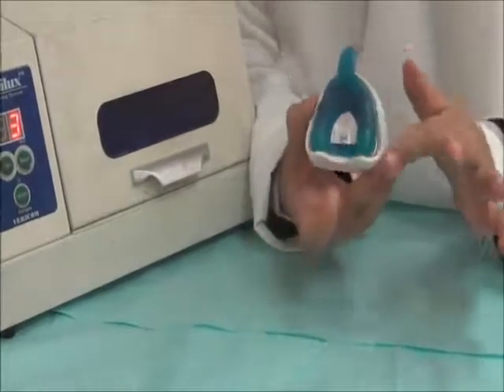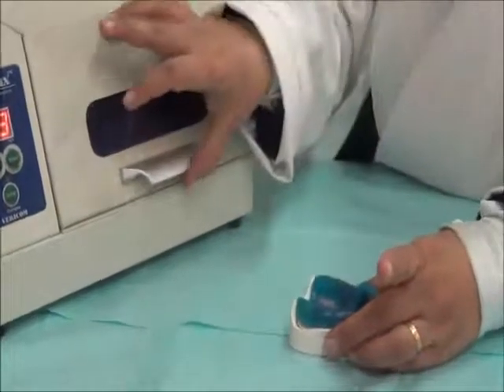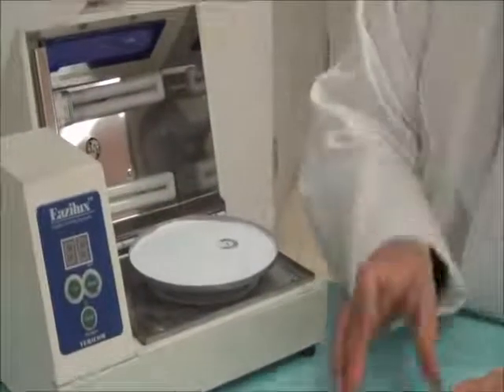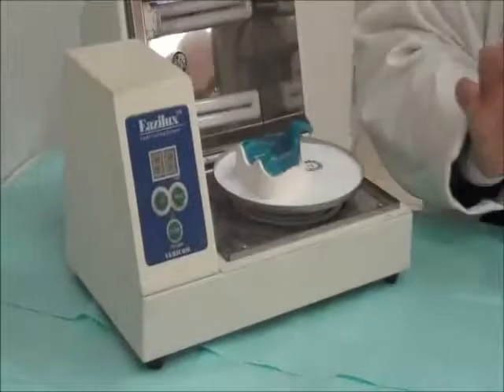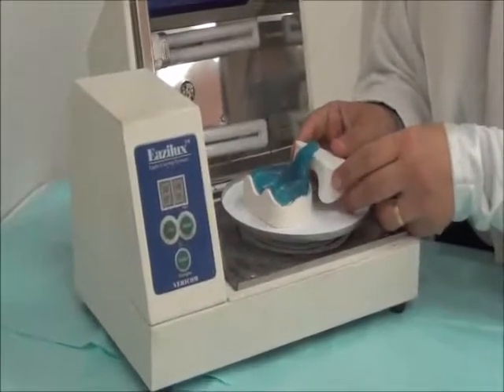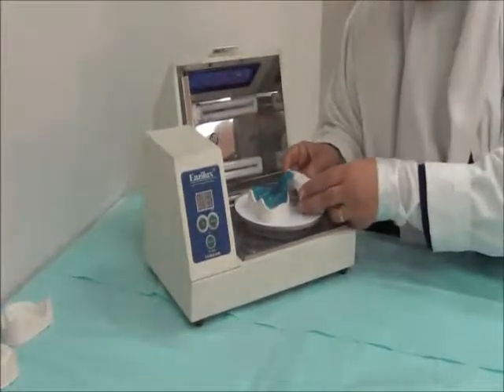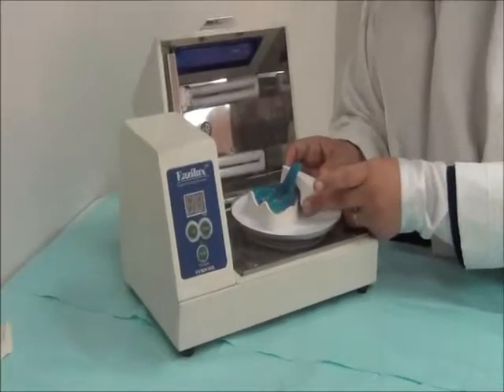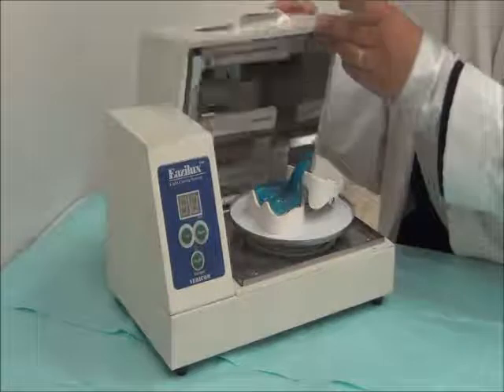We also make sure that there are no projections inside the sulcus outline, because it's easier to remove them when it's soft acrylic than in the final material. We place it inside the light cure. We might get another cast, or a cup or any other hard object, that could support the handle while light curing. We stabilize it, make sure it's stable, and then we begin our light cure.